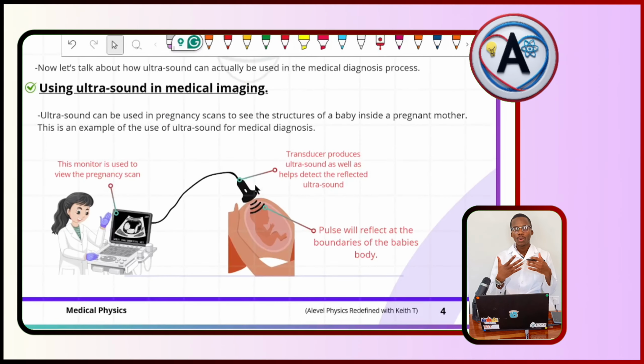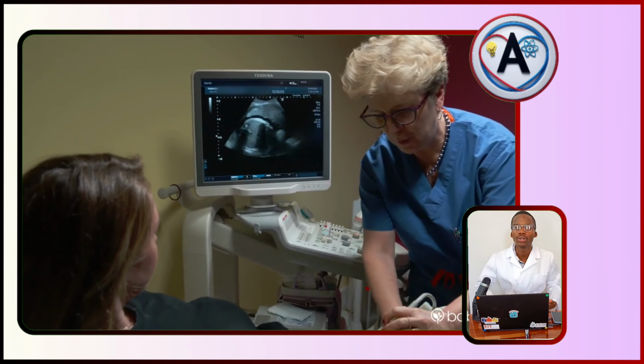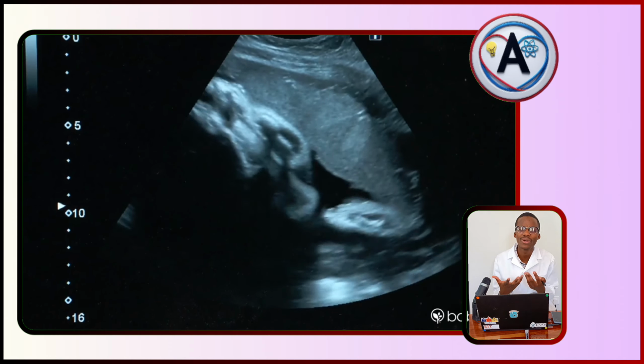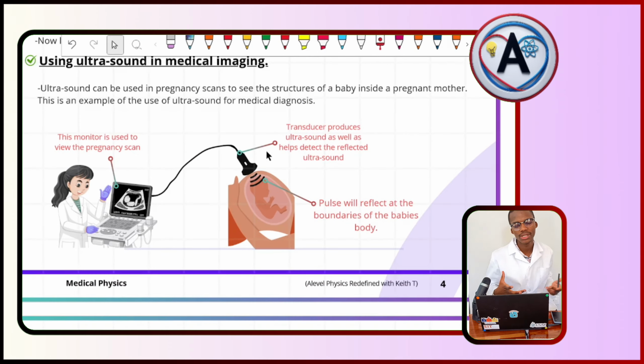Moving on. We've talked about how ultrasound can be used for medical imaging. An example is monitoring the inside of a pregnant mother to understand what is happening inside. How can we view the inside of a mother without opening the stomach, because that would harm the child, right?